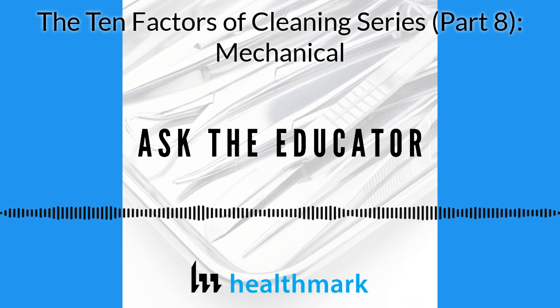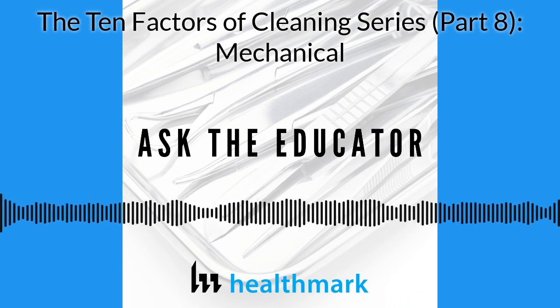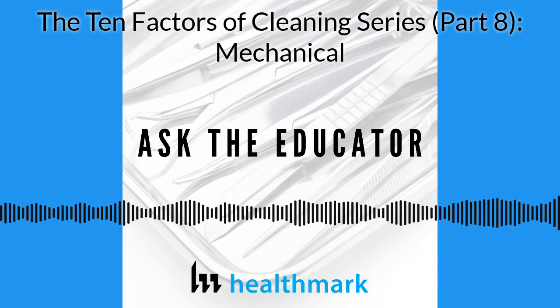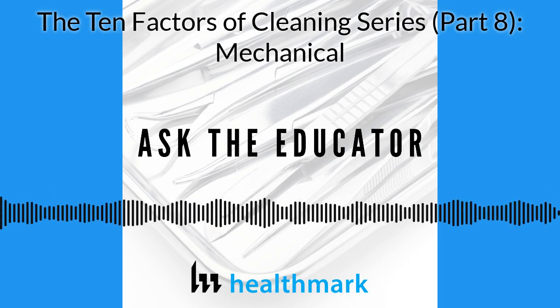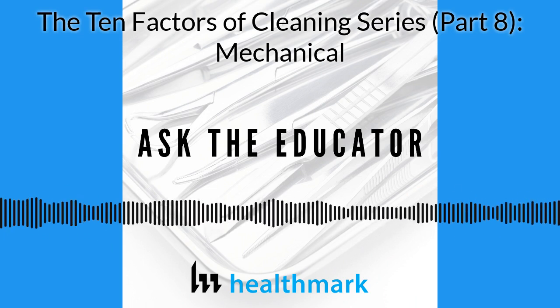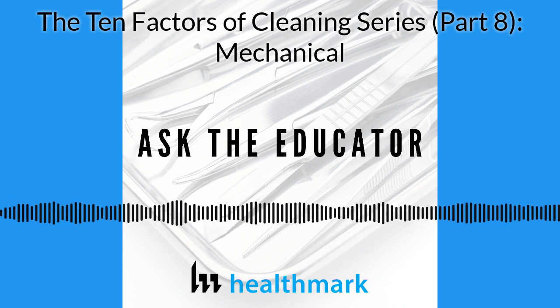Well, that's really good because we're going to distinguish this. When you think of mechanical in manual cleaning, it's the brushing, and we have a lot of podcasts on brushing and how you take that friction of the brushing and put it over to automated washers, sonics, cart washers, a lot of the different mechanical things. So we're going to talk about that, and we'll start with just the automated washer.